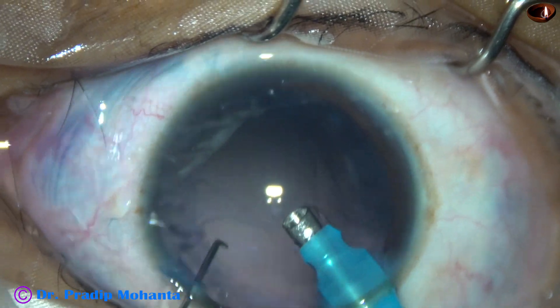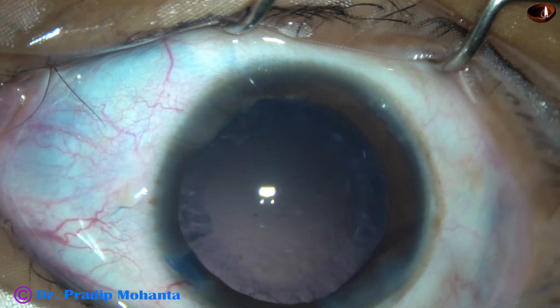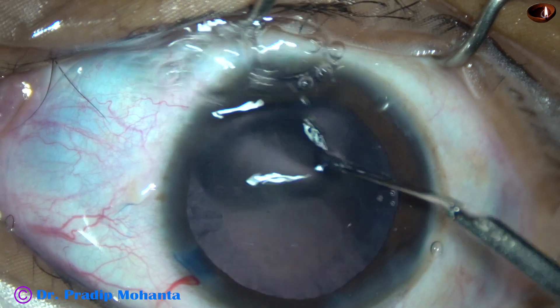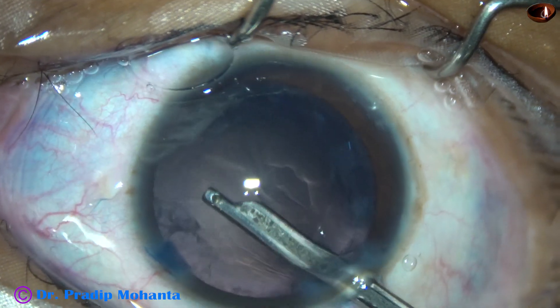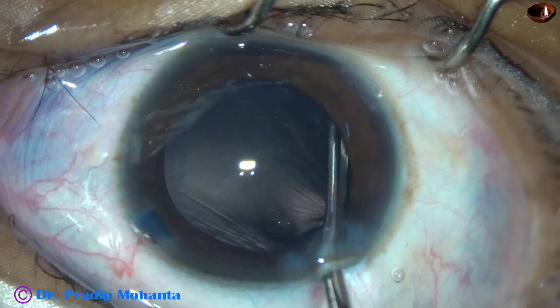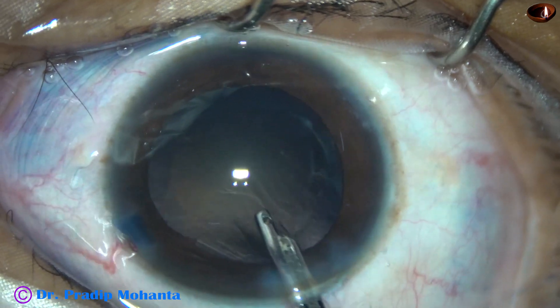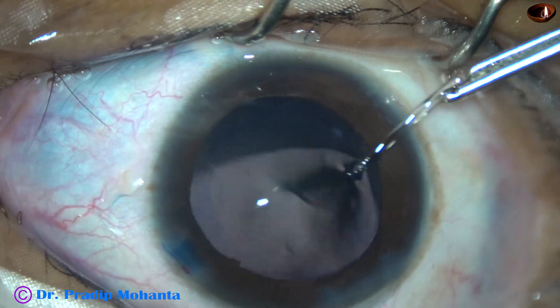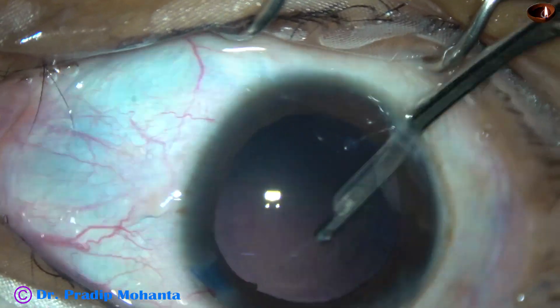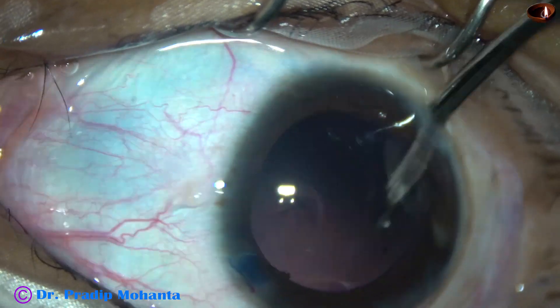This is real-time. Henceforth, this is 150% speed. Cortex is removed with the help of a 23G Simcoe cannula. There is a side port at 7 o'clock also, and through that side port it was very easy to remove the cortex from the upper part.